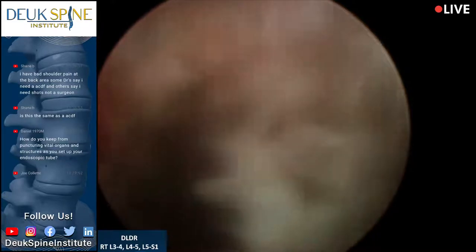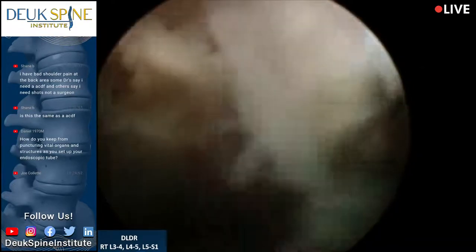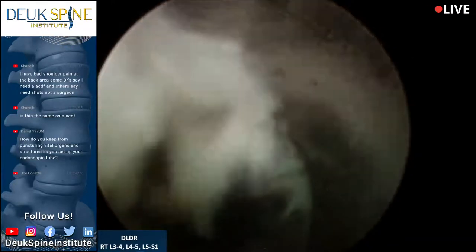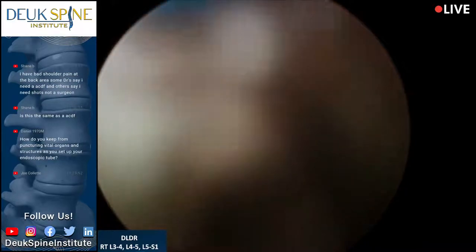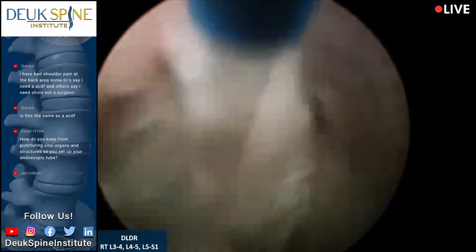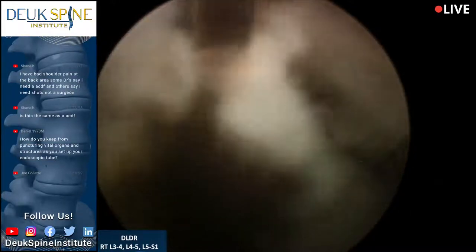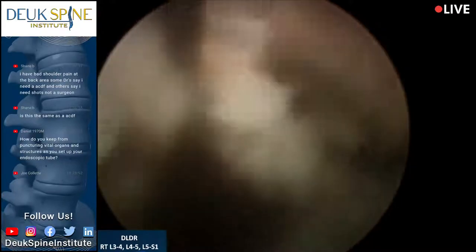And you can see it's protected. Let's see the laser one more time. There's a little bit of annular tear still there I want to clean. But you see how the nerve root is outside the tube, protected during the surgery. So we know exactly where it is, and we make sure it's not being damaged during surgery.